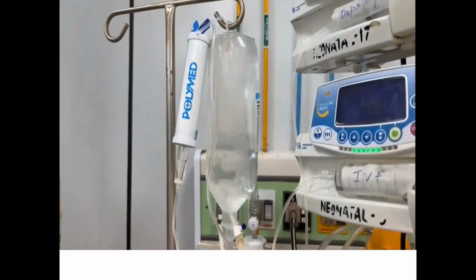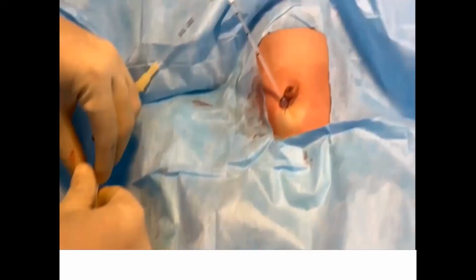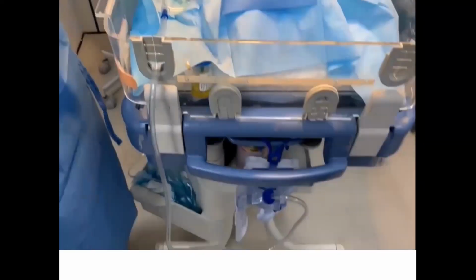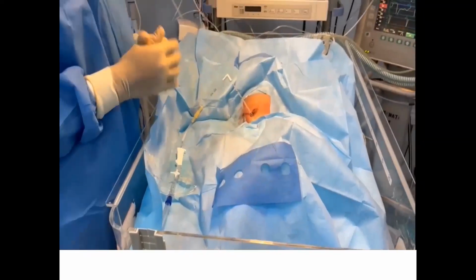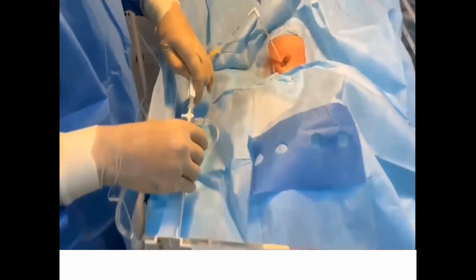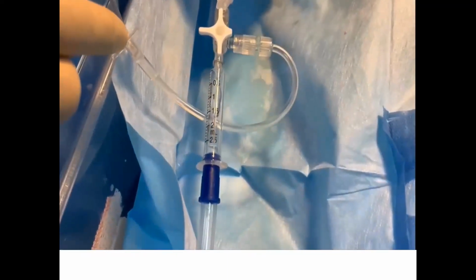We have to open the inflow circuit by opening the inflow track port of the triway, and we have to instill the required amount of the fill volume into the peritoneal cavity. It takes about 5 to 10 minutes of fill time, and then we have to open the other port of the outflow tract after a dwell time of approximately 20 to 30 minutes. The correct position of the PD catheter will be confirmed by the egress of the dialysate fluid into the outflow tract. And this completes one cycle of peritoneal dialysis.